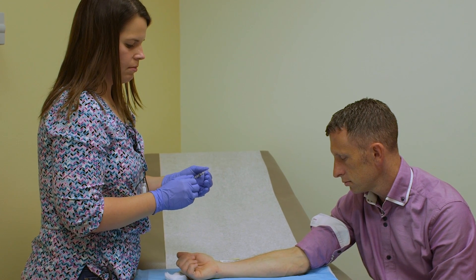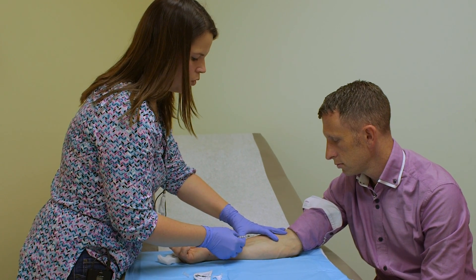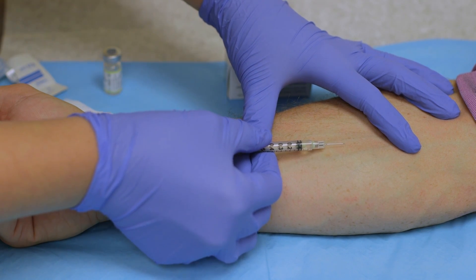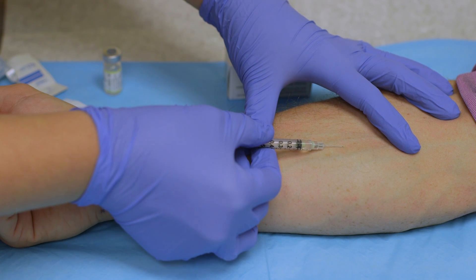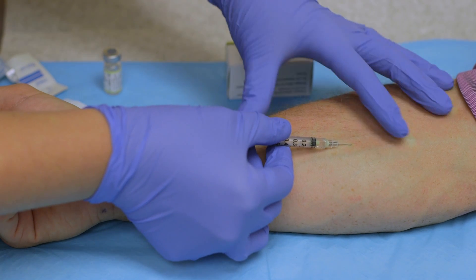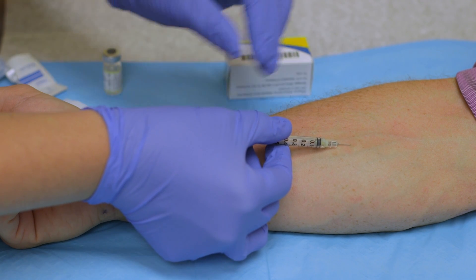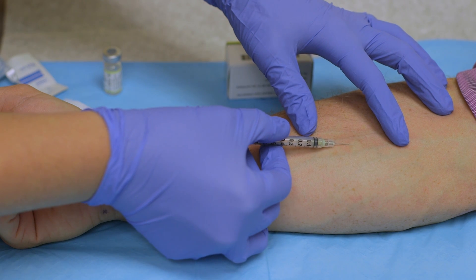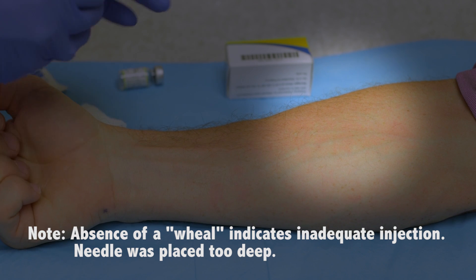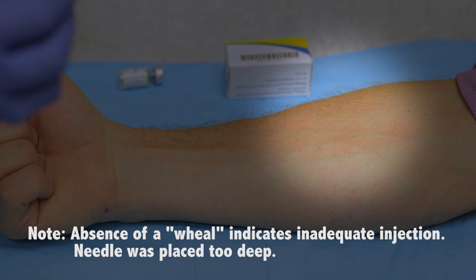Take your needle, make sure you uncap it, and the bevel is going to be facing up. Pull the skin tight and hold the needle at about a 10 degree angle. Go right into the skin and inject the medication. Then slowly pull out the needle. Make sure you recap it. If there's any blood you can wipe it with the gauze, but do not place a band-aid over the site.